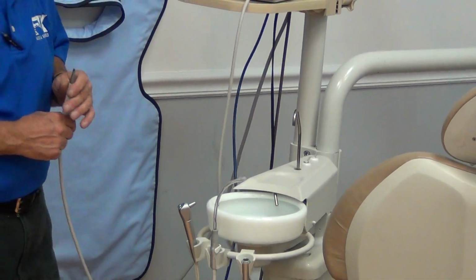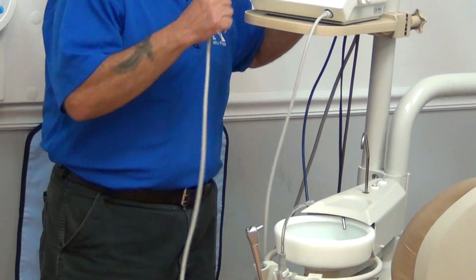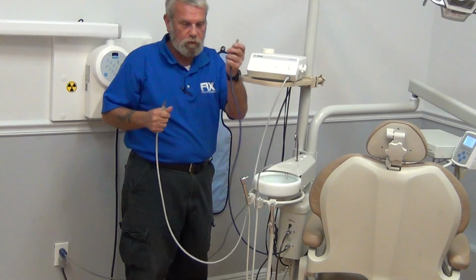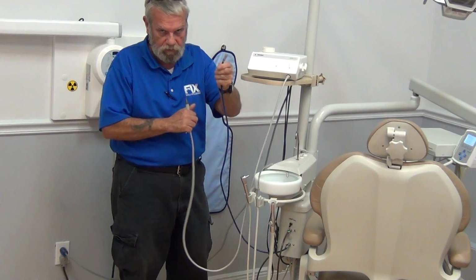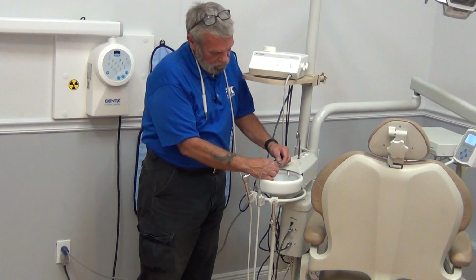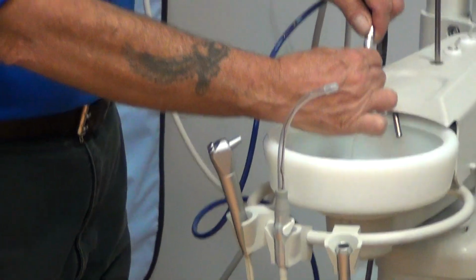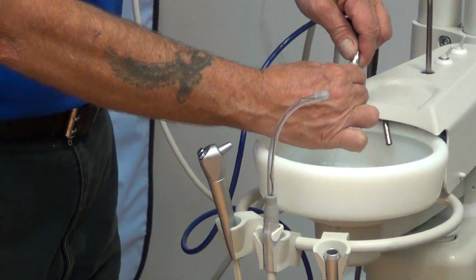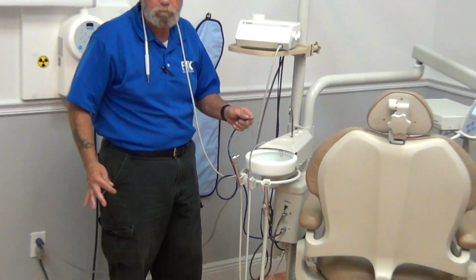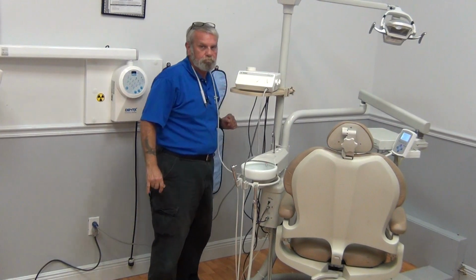On this particular unit, the EMS unit, if you still don't have water, you disconnect the back of the tubing, the blue tubing which signifies water. It's a quick disconnect. You can stick even the syringe tip in the inside and look at the water that's coming out of there. That's confirming that you've got water going up to the unit as well. Okay. All systems are go as far as that's concerned. We're going to plug it back in.